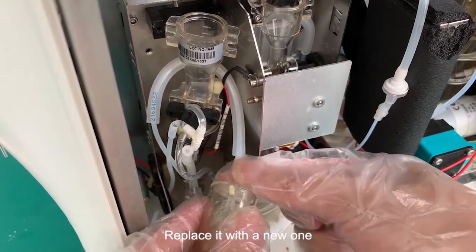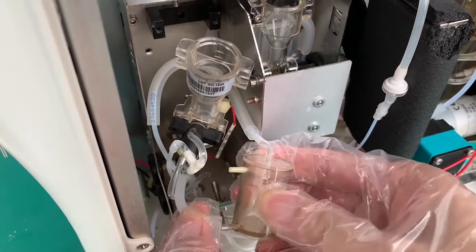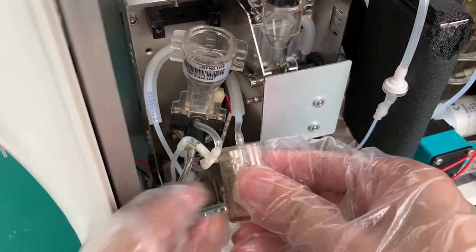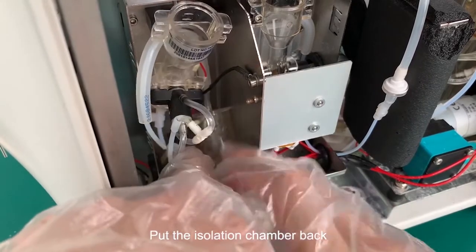Replace it with a new one. Pay attention that the upper port of the RBC isolation chamber is blocked. Put the isolation chamber back.